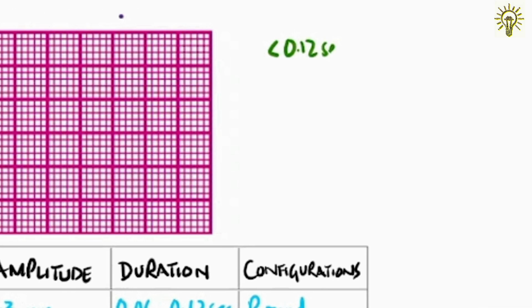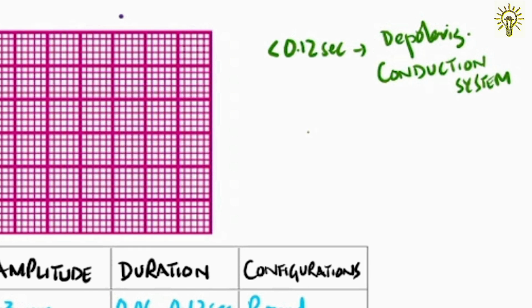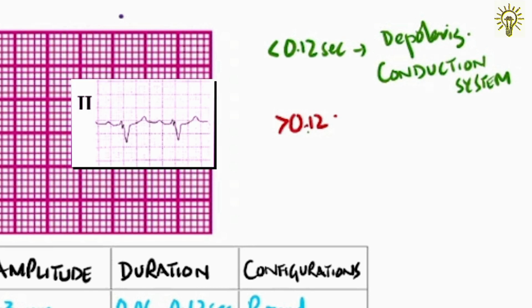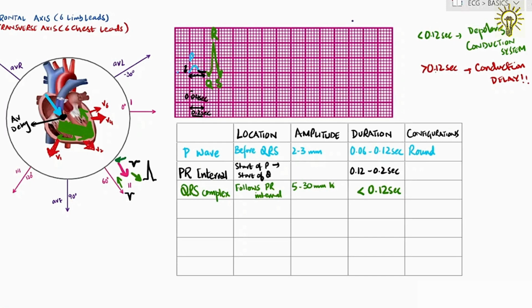Short QRS means depolarization has undergone the usual normal bundle of His and Purkinje fiber system for quick depolarization, hence the shortened time. Prolonged duration or broad QRS signifies conduction anomaly, meaning the origin of depolarization may not have followed the usual path of depolarization. This means ectopic sites of origin and slower ventricular muscle conduction without a dedicated fast conduction pathway.